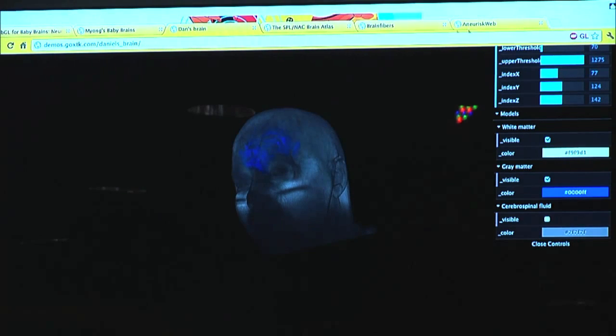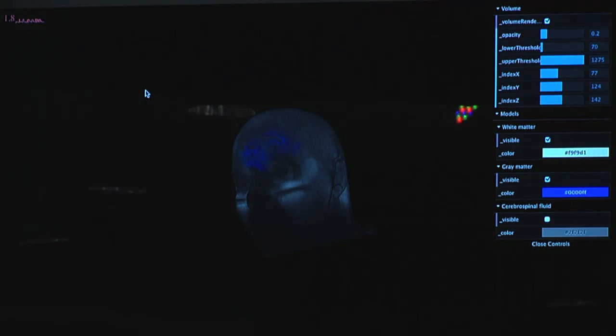I think you guys got a good idea of what we use WebGL for at the Children's Hospital, and we are hoping that more people get interested in that, and especially other researchers and other hospitals want to share their data online, and I think that's the right way to go. So the whole presentation, which I made in Impress.js, where you can embed the WebGL, is online at babymri.org/Orlando. And thank you so much for listening.